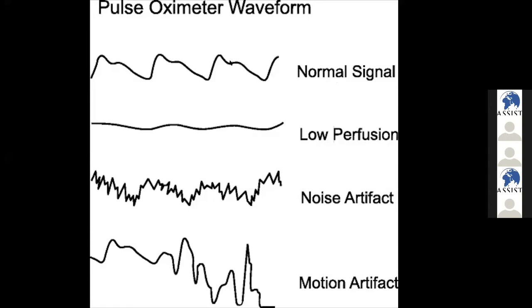There was a good question about this issue of light. I saw in my experience that some theater lights were causing issues when we were taking the pulse ox reading. So I saw this question. I think you already responded to it. And also getting the right size of probe is a good thing. We're still struggling with this on our side.